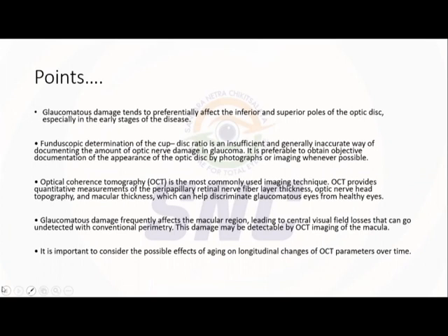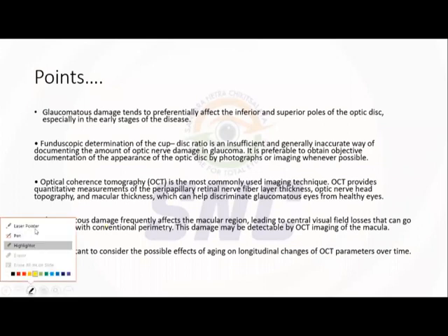And you have mentioned CSLO. That is not being done right now. So the OCT, after completing your PG, you should read the OCT report. Not only just by seeing the color coding, the sectoral thing you have mentioned, whether it is red or green. You should not go directly to the green or red. You should focus on a lot of points in the OCT report.